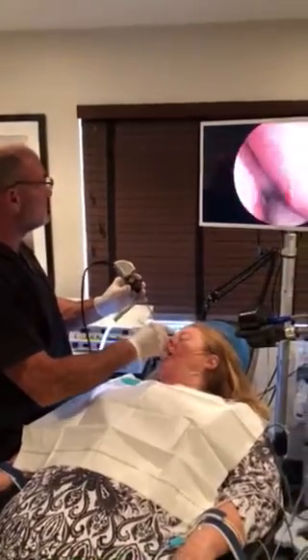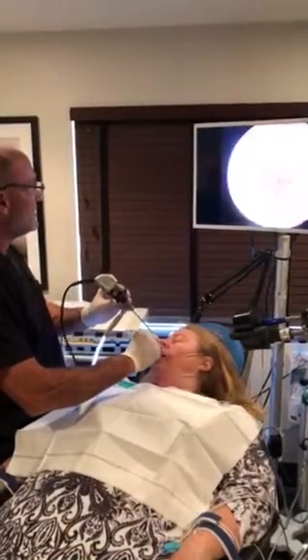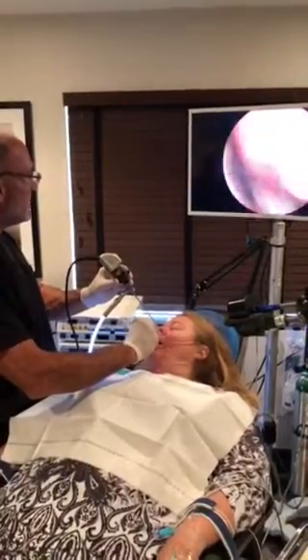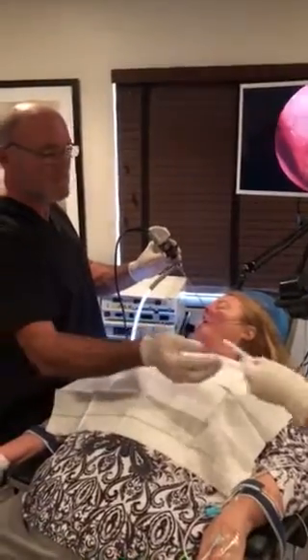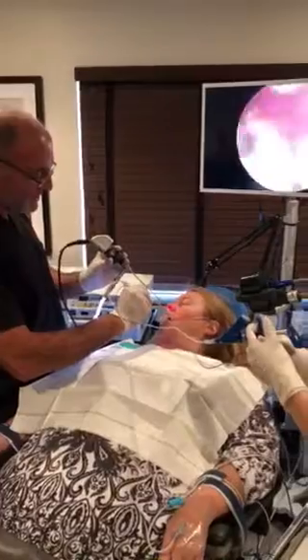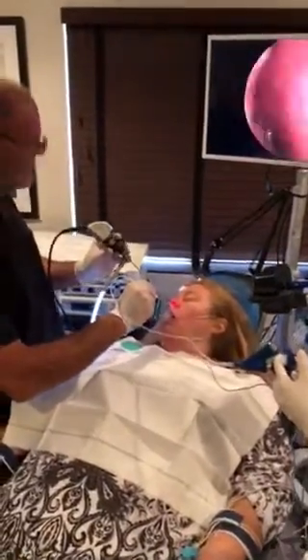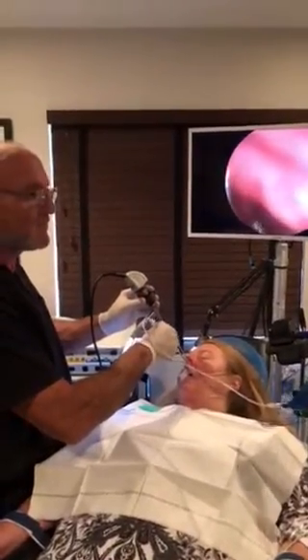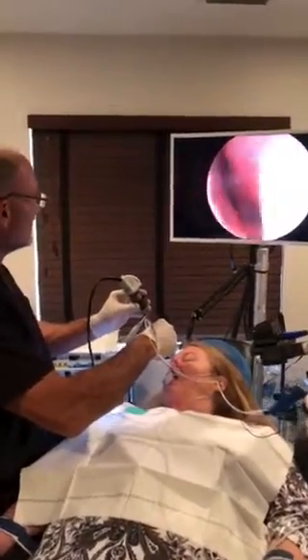That opening will stay open and continue to function long-term — there's no reason why it should shut down. And here we're just moving the turbinate. Now we're going to be in her right maxillary sinus, and this is the sinus on the CAT scan that has her worst disease.